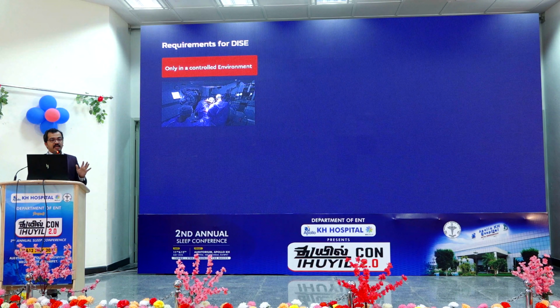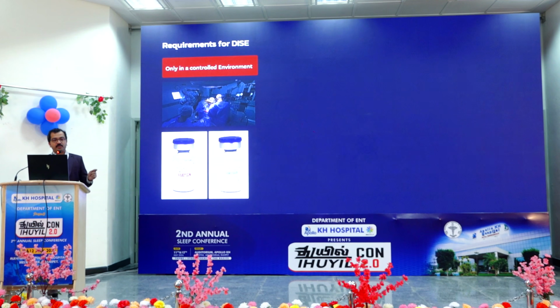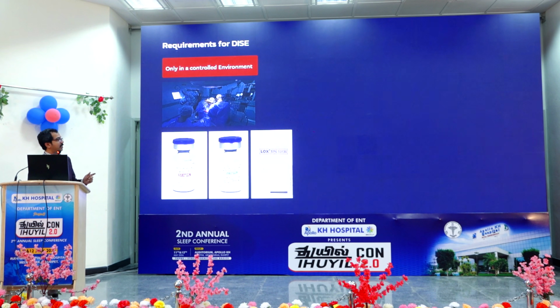So it should be done in a controlled setting environment, in a dim-lit OT with less noise. Usually 1 hour prior to the procedure, you give the patient something to reduce the secretions, which can be atropine or glycopyrrolate. And before that, in adults, usually you spray with 10% lignocaine when the patient is on the bed. It is usually done in supine position.